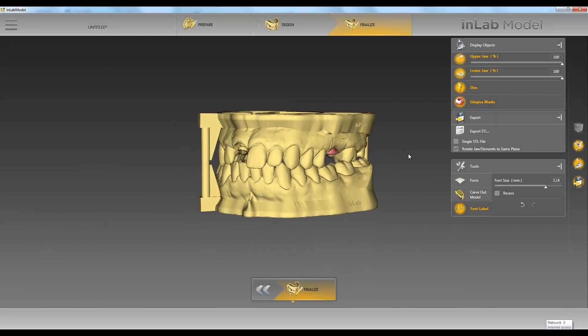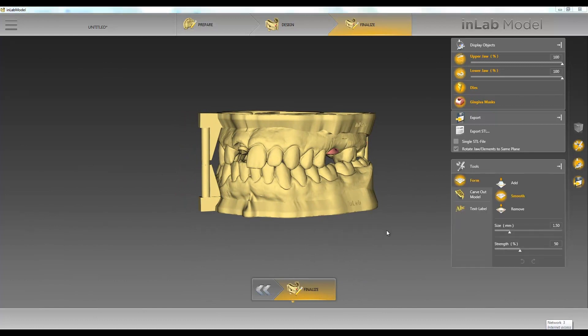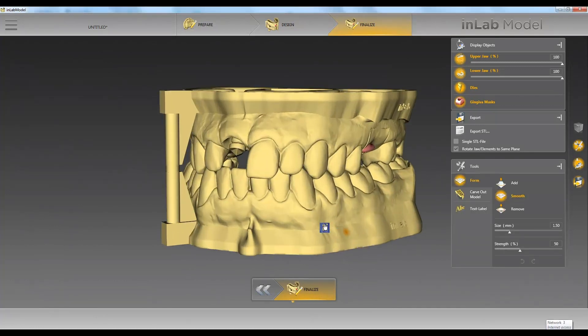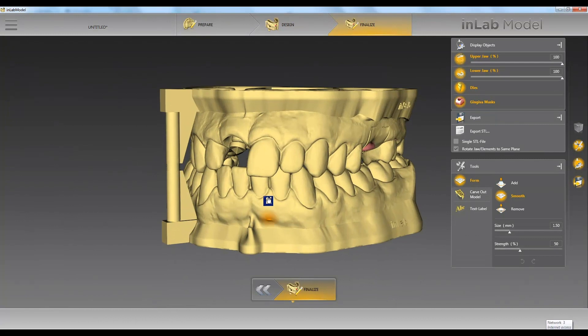Now that we've added text we can use our form tools. So let's say you want to smooth anything out on our model, or add or remove.